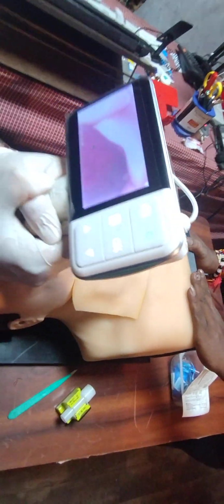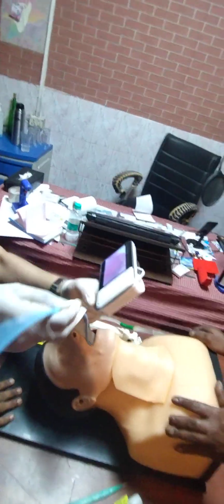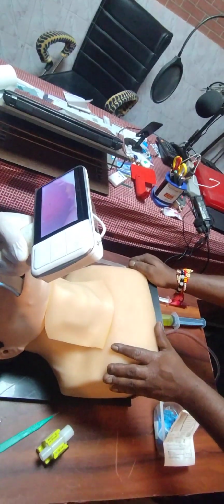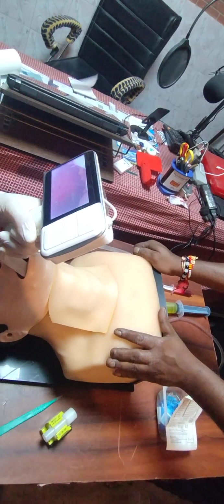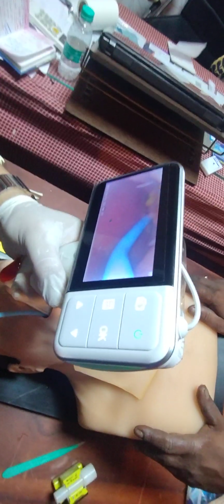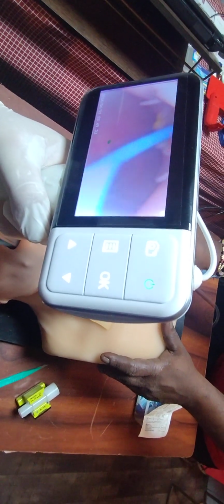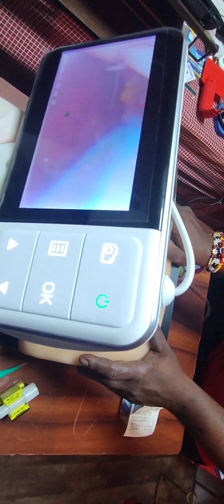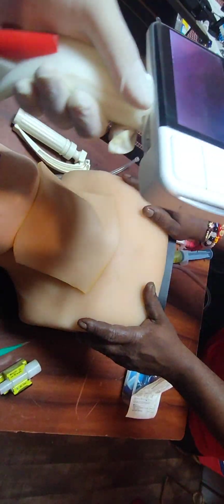Now I am seeing the glottic opening also, and so now I am seeing, and I have to, yes, you can see, tube.